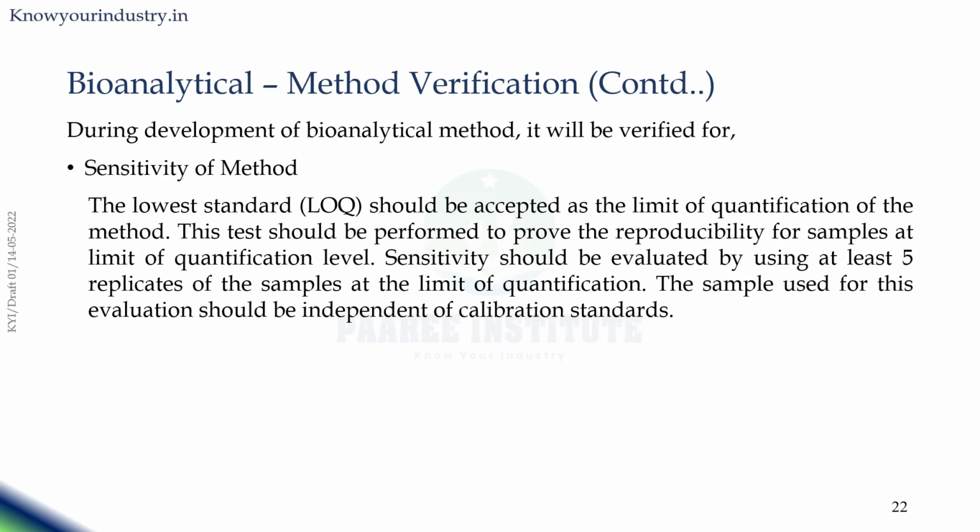The samples used for this evaluation should be independent of the calibration standard. So we have to prepare the LOQ samples, inject them multiple times and see the reproducibility, and there should be an acceptance criterion: the precision of the LOQ values should be within a certain percentage, 10% or 15%, which has to be established. Then the sensitivity of the method has been proven.